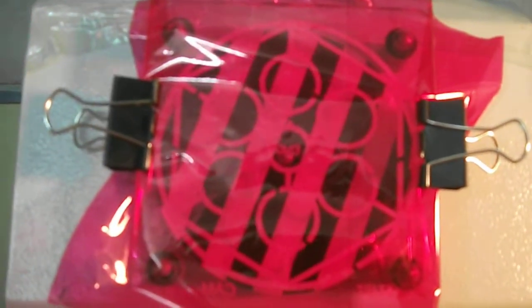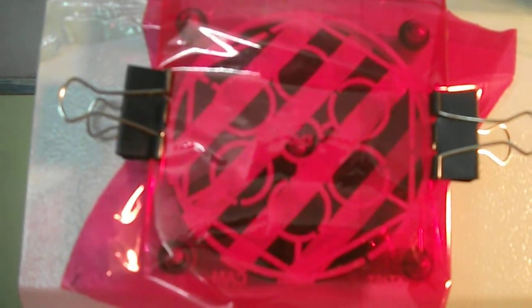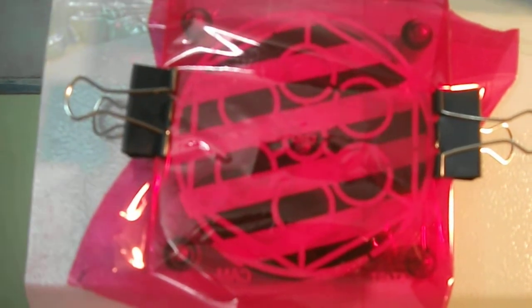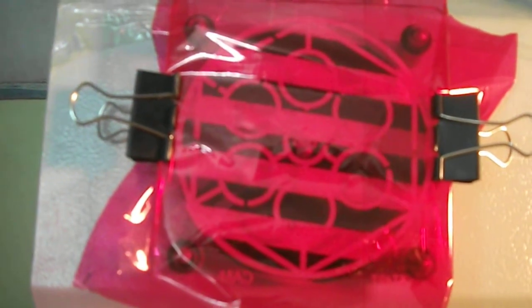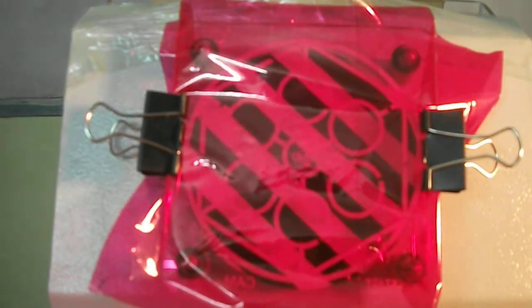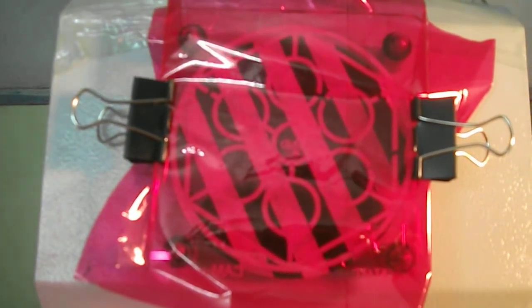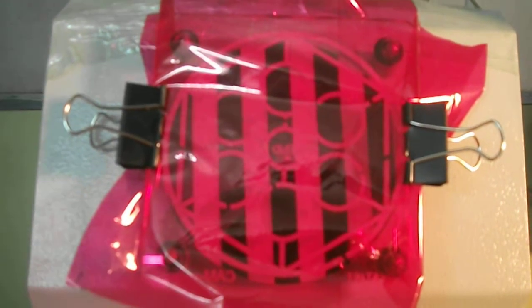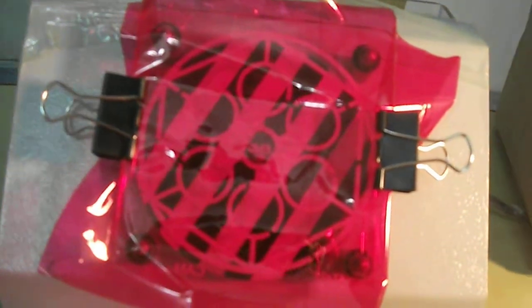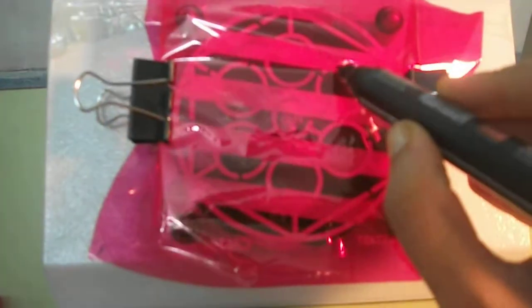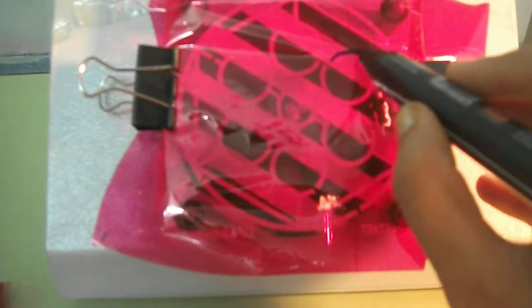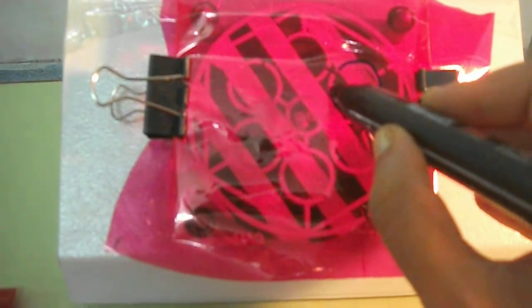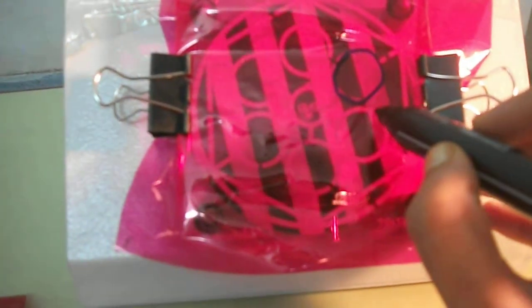So now you see the disc inside is rotating at 2 rpm. Now you have to tell your child that he or she has to wear their normal spectacle with the better eye being patched. Now with the help of a marker, the child has to draw the design he or she is seeing, very much like this.